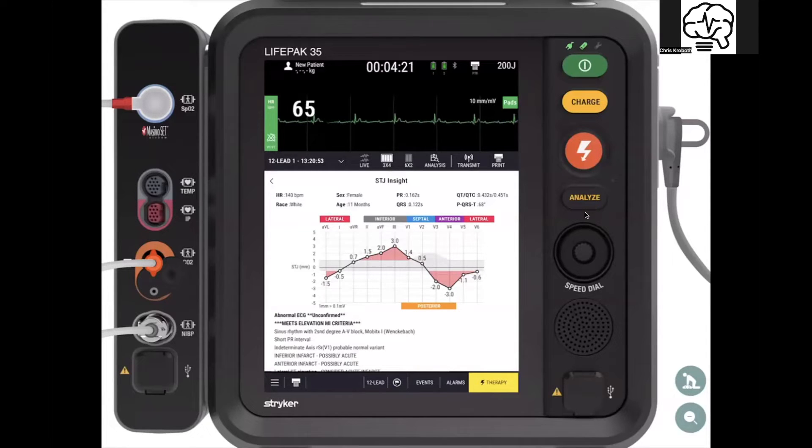This is awesome. In the past, we've spent a lot of energy getting people used to remembering which lead is which artery, which leads are contiguous, and who's next to each other. A lot of times people forget — for example, if V2, V3, V4 are depressed, what would be the reciprocal elevation you need to rule out? Well, STJ Insight does that for you.